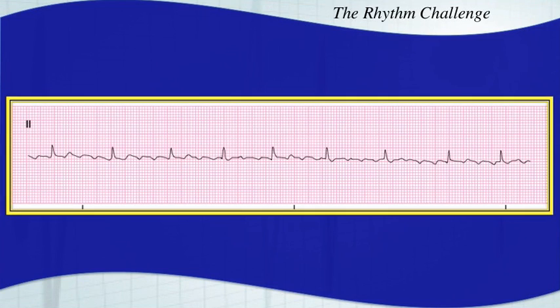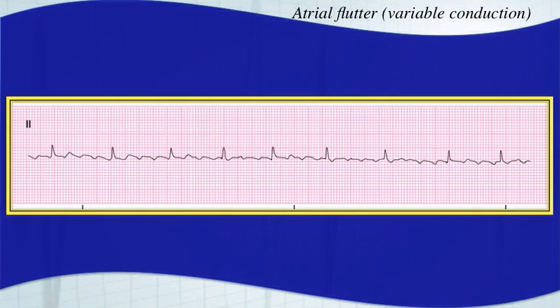Here's your next arrhythmia. This one should look vaguely familiar. It is atrial flutter with a variable conduction — variable conduction because your R-to-R interval here is much different from this one. So this is atrial flutter with variable conduction. That is a sawtooth pattern for the atrial activity.